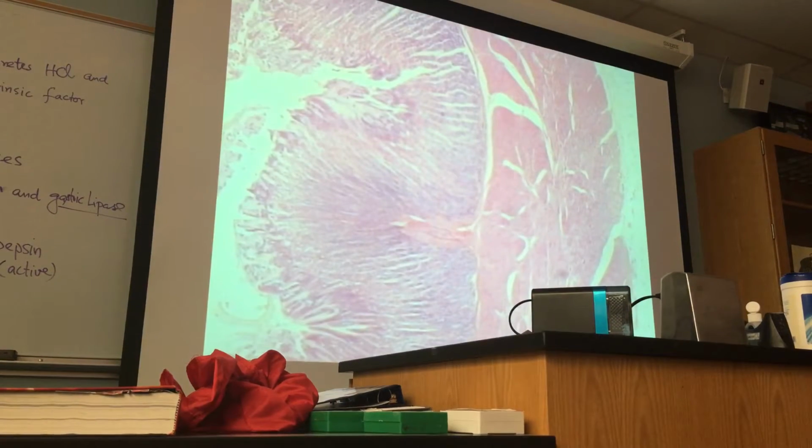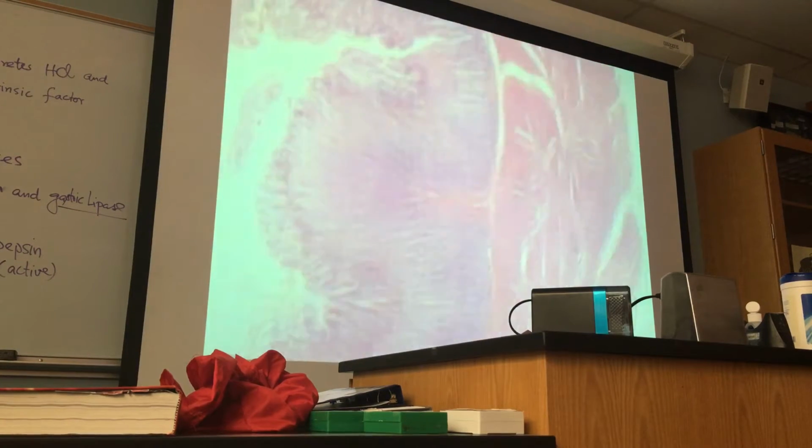Here we have these are all gastric glands, and when I go to higher magnification, then you can see the cells pretty clearly.